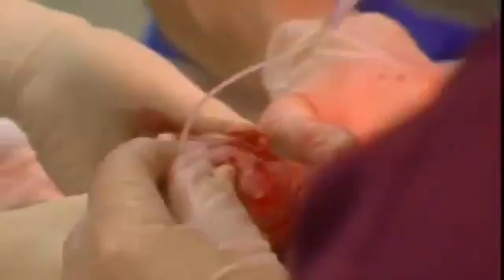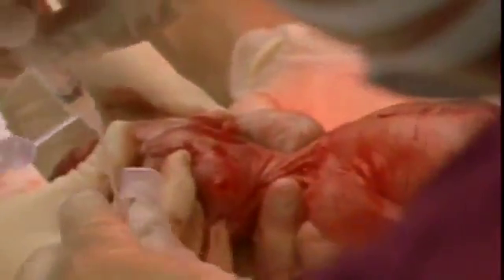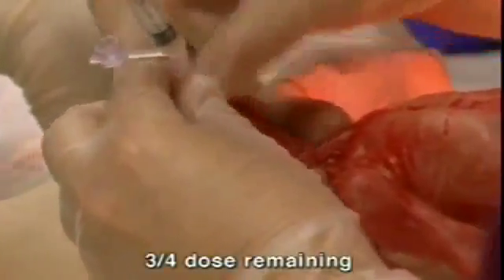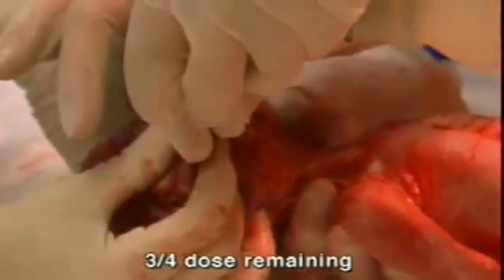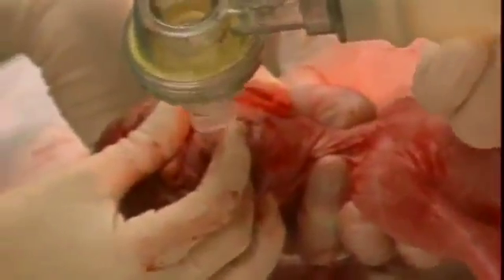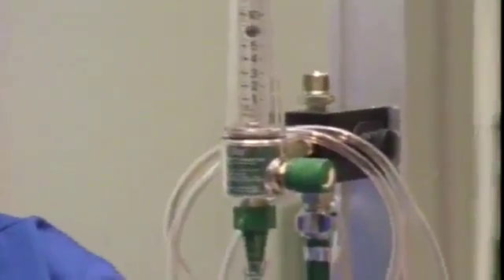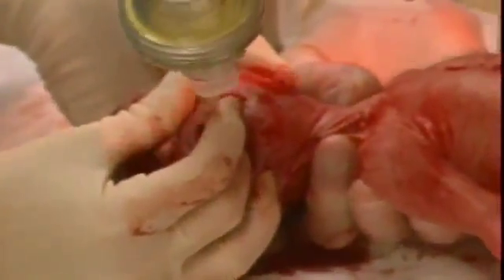Lower the head and one shoulder slightly. Insert the shortened catheter fully into the endotracheal tube. Inject the first fractional dose. Ventilate for 30 seconds after each fraction to distribute Surfactant. The ambu bag should be capable of delivering 100% oxygen to prevent cyanosis and should provide adequate air exchange and chest wall excursion. Next, rotate the infant so that the head and same shoulder are slightly up.